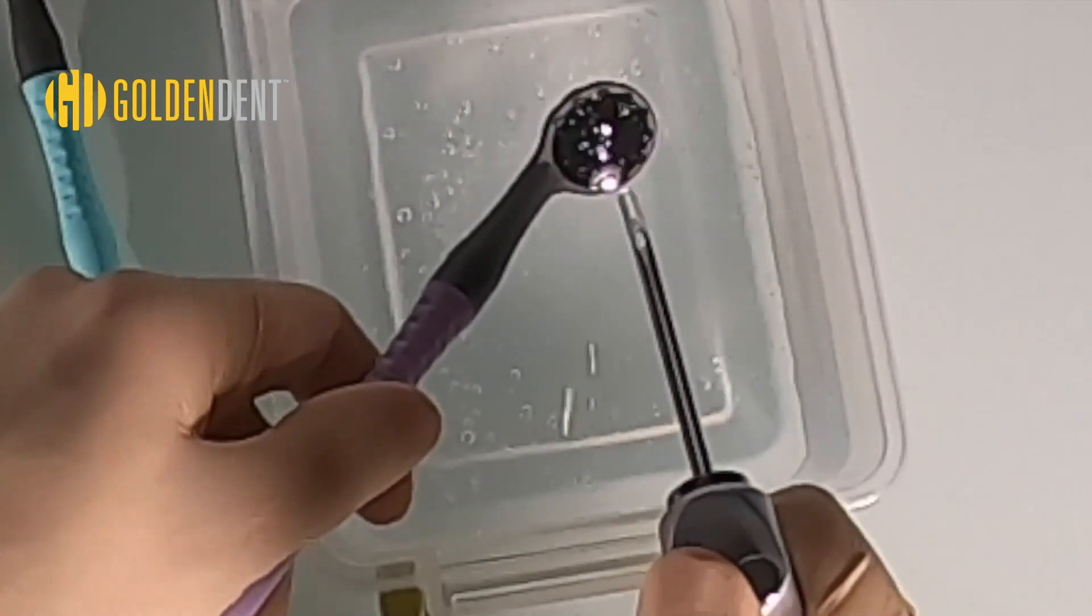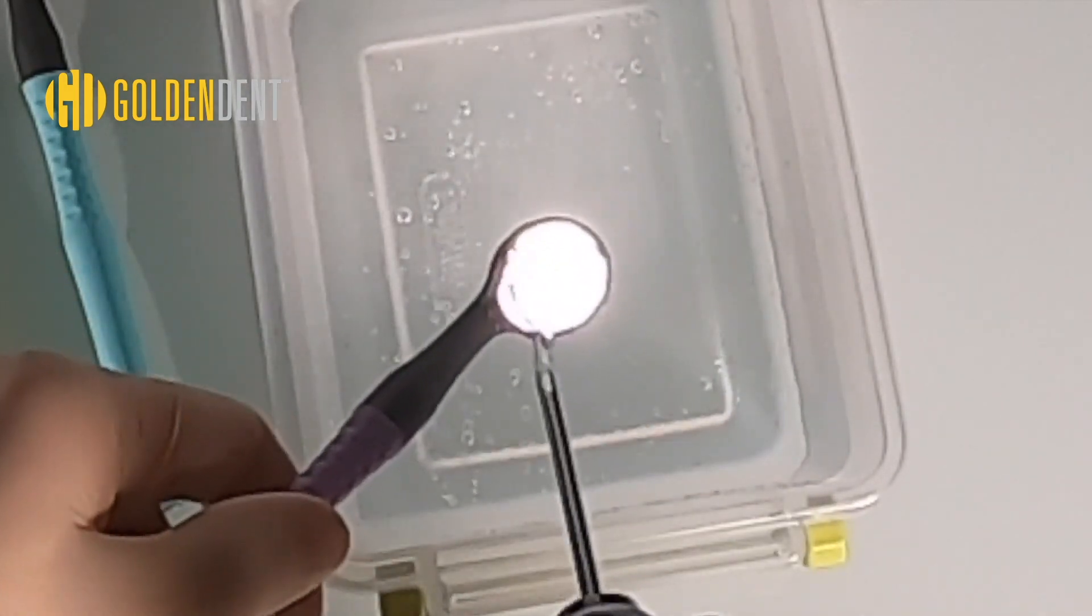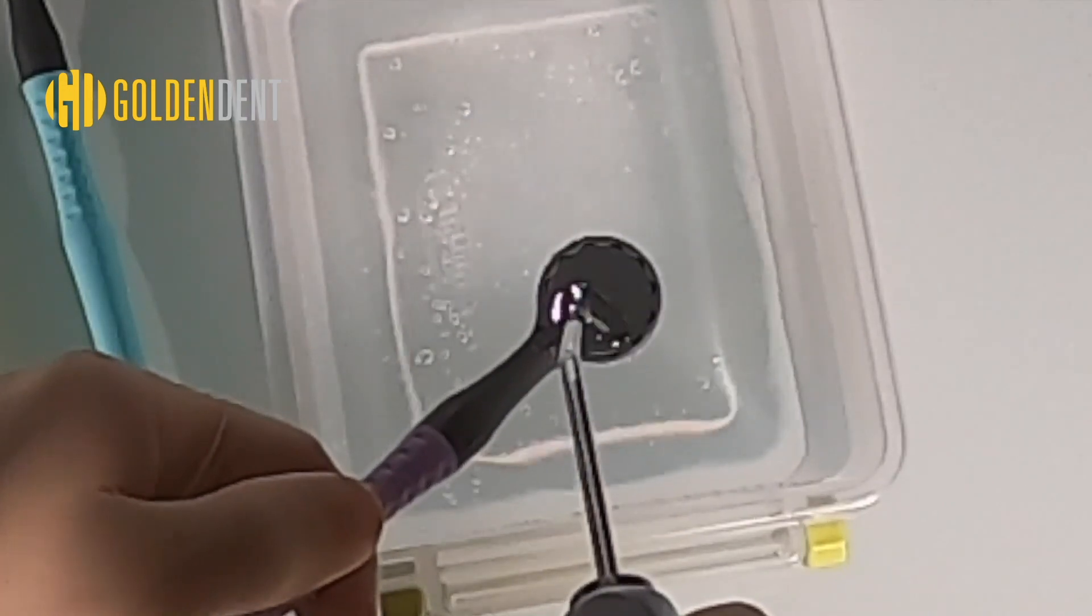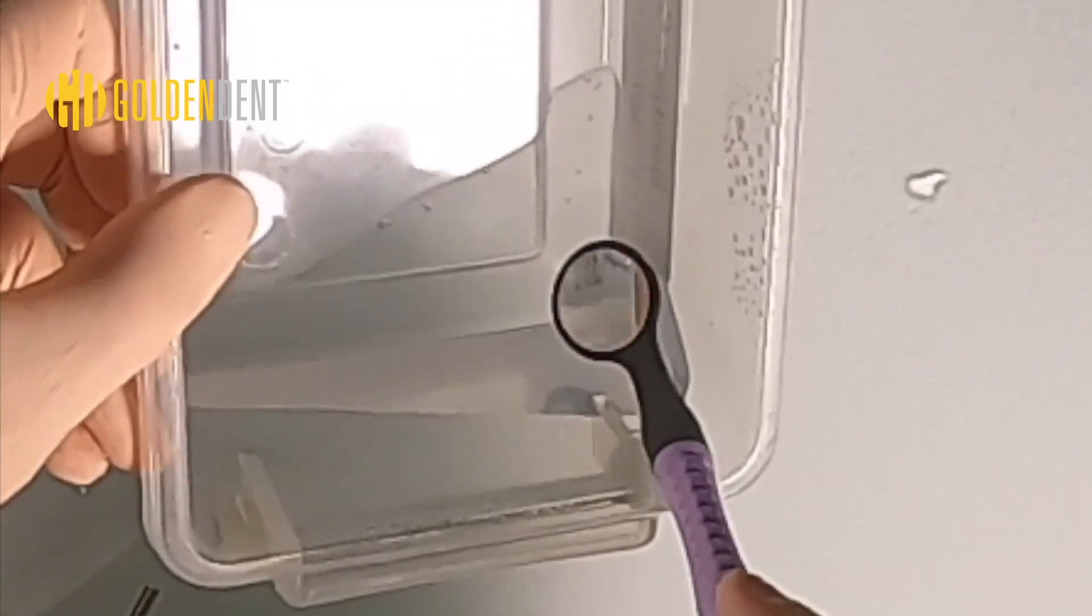The M7 mirror lens provides high definition with great suction power. Look how quick the water suctions through the mirror.